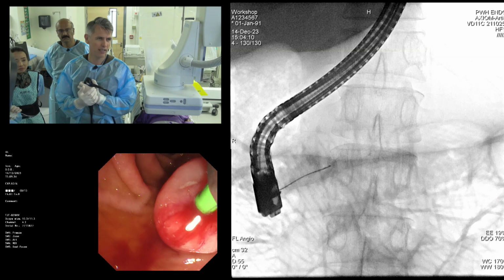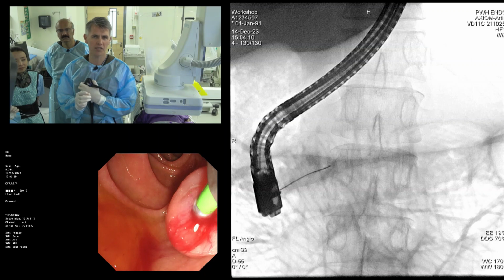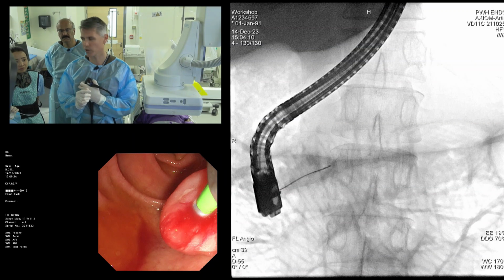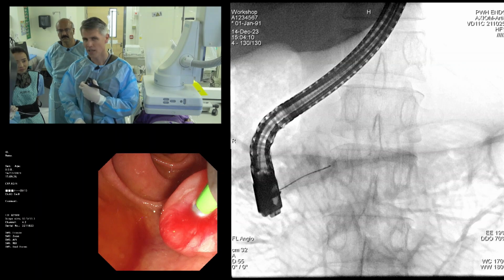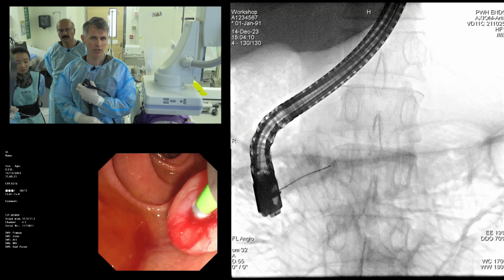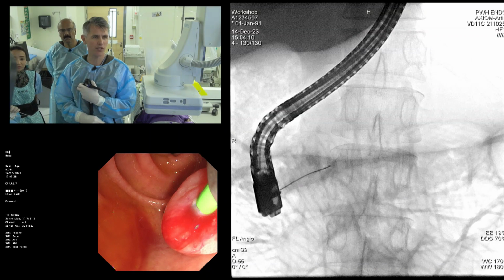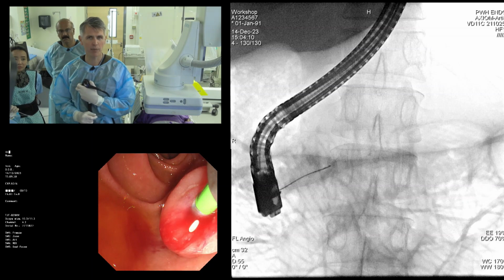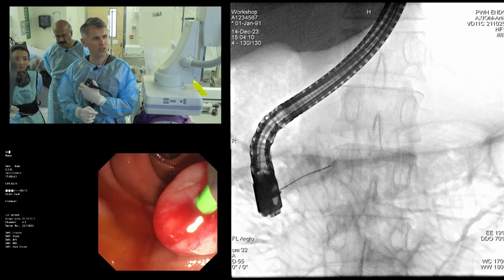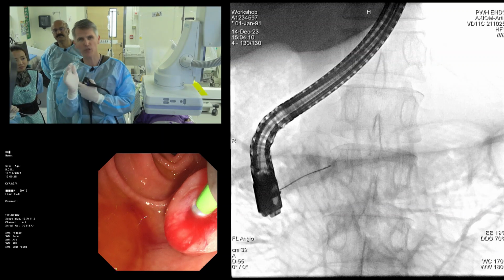In case we had a straight position and put a guide wire alongside, we could have used a balloon or even a Soehendra stent retriever to drill through the stone. But in this case, it would be too risky. The second option would have been to put in a pancreatoscope, for example the SpyGlass or the IMAX scope that is available right now. But we can also anticipate that we cannot visualize the stone because it is located behind this very sharp bending.